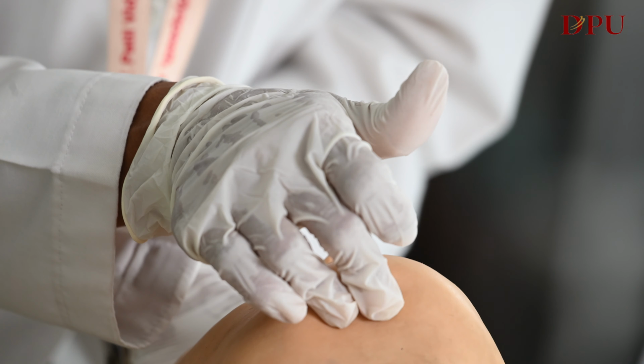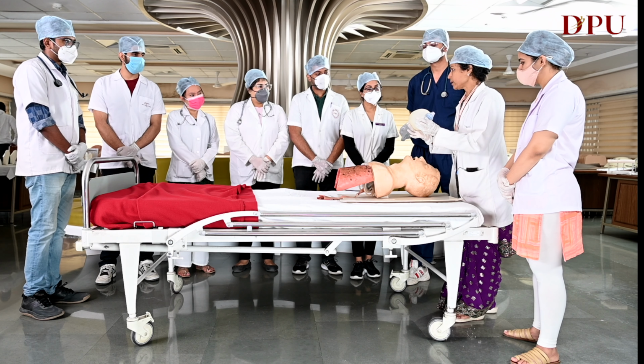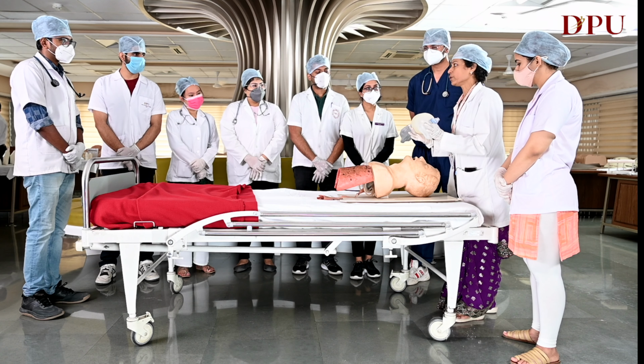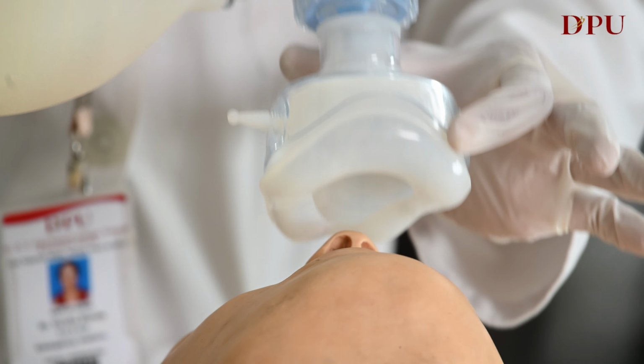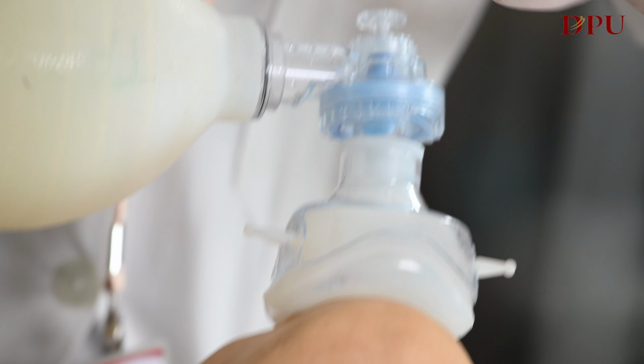After the airway is open, in hospital scenarios, you use the ambu bag. It gives room air which contains 21% oxygen, which is good enough for survival. So you hold the mask in this manner. This is called the EC technique. This is my C, this is the E.